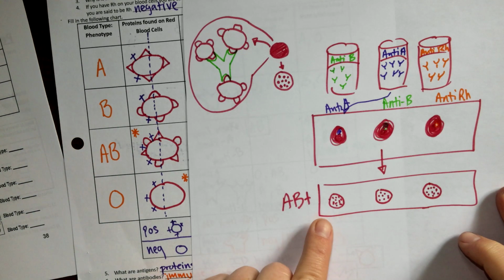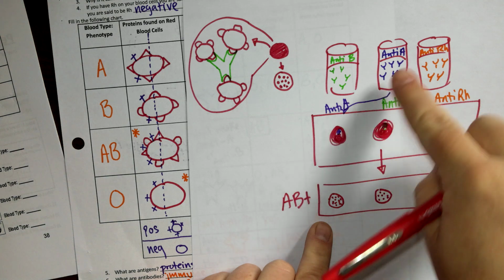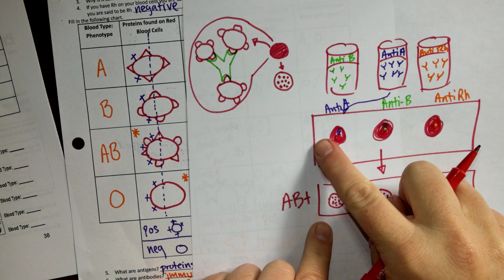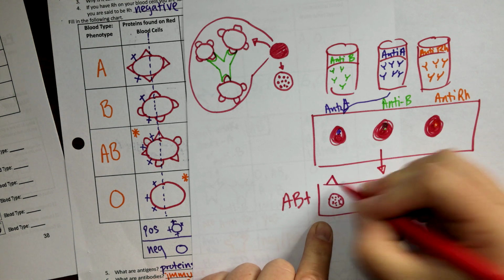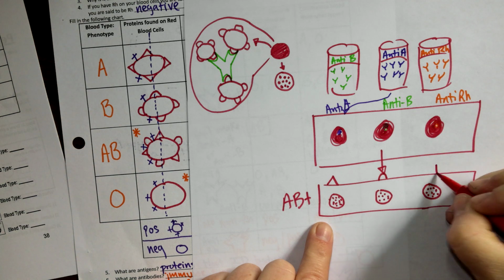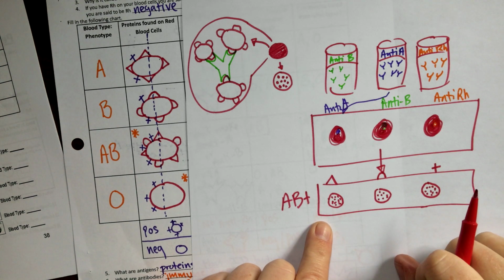So, if we mix your 3 drops of your blood, 1 with anti-A, 1 with anti-B, 1 with anti-RH, we can tell what shapes your blood has. If it clumps, you have triangles. If this one clumps, you have bumps. If this one clumps, you have plus signs. And if they don't clump, then you don't have that shape.